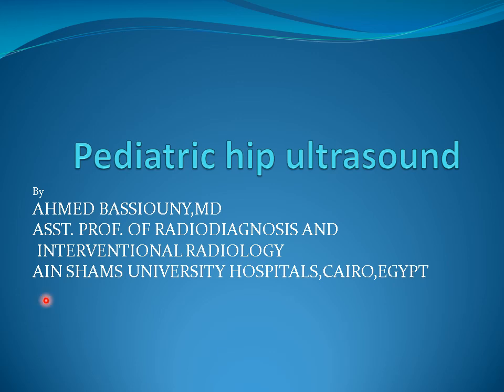Hello everybody. Today's lecture will discuss the pediatric hip ultrasound.